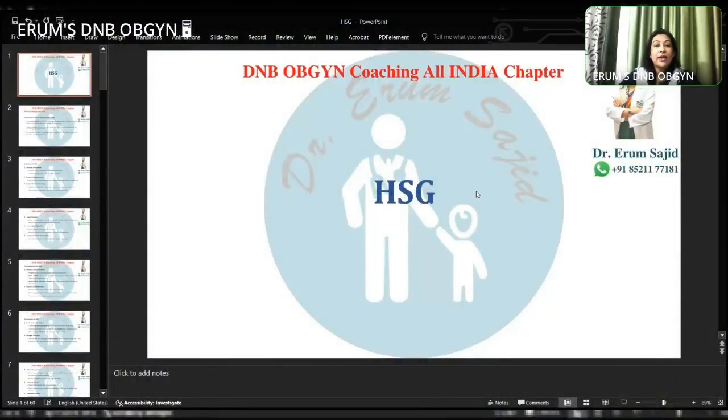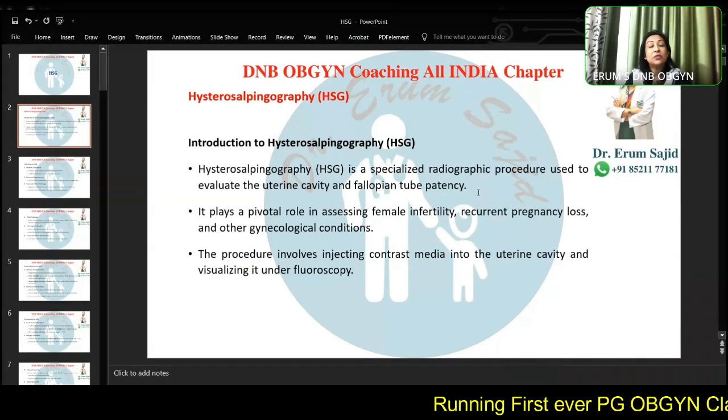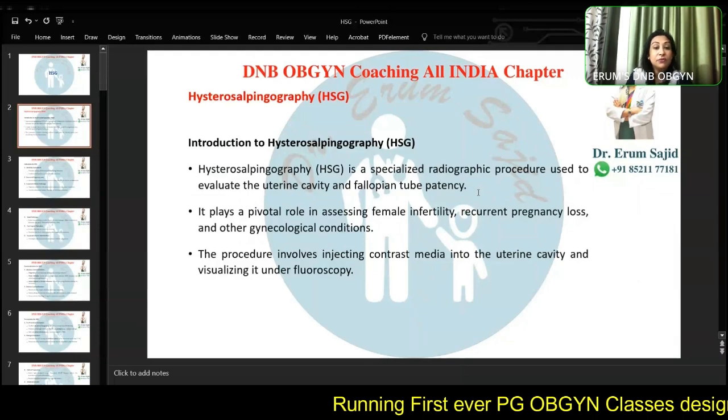Okay, all right. So I welcome one and everyone to the class today, and we're going to be discussing the HSG, first the procedure, and then the different films.